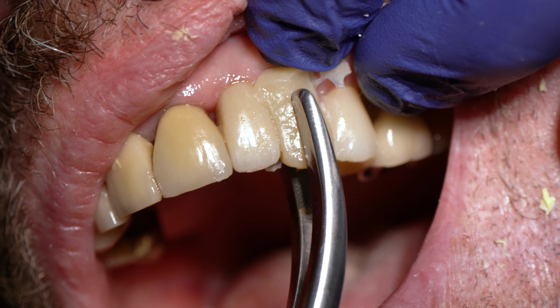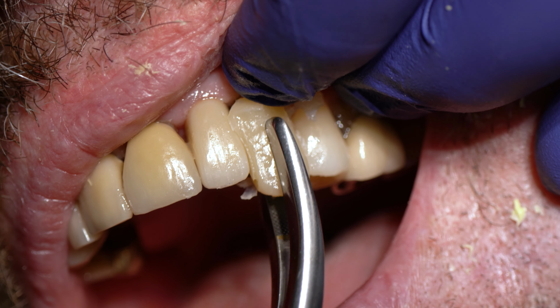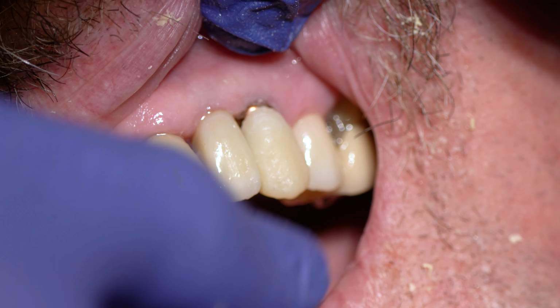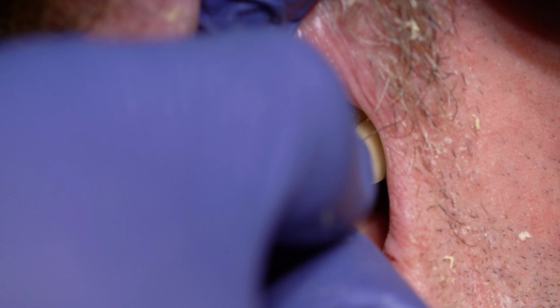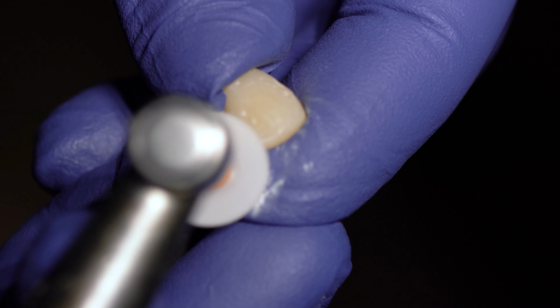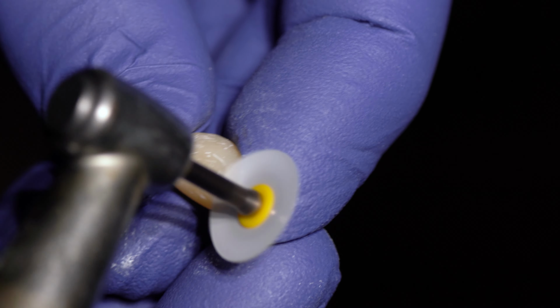All right, so now I took my mold already, and this is my temporary on there. So I took my impression already. Now I put my temporary acrylic in there, and we're pulling this guy out. Boom. Now it's time to adjust this tooth. All right, that's my temporary tooth. I missed some of the margin when I was making the template for my temporary, so I had to extend it a bit. So it is missing a bit of the margin. That's just on the temporary. On the final, I used my final impression, so it will turn out just fine.